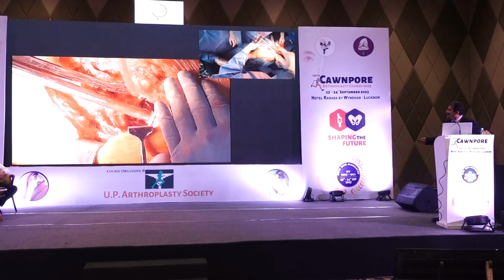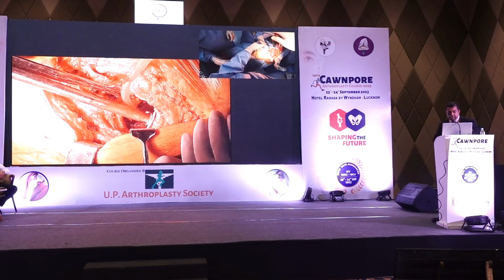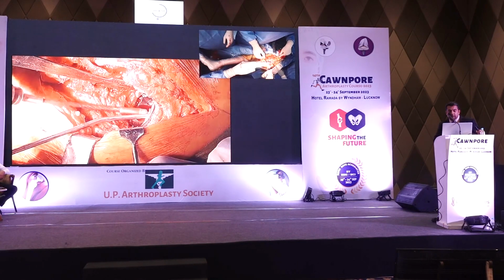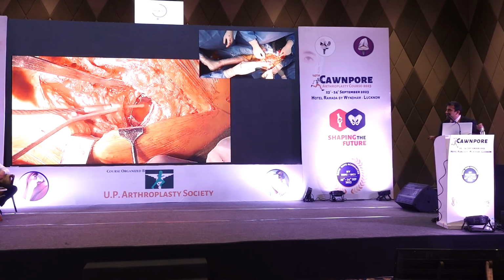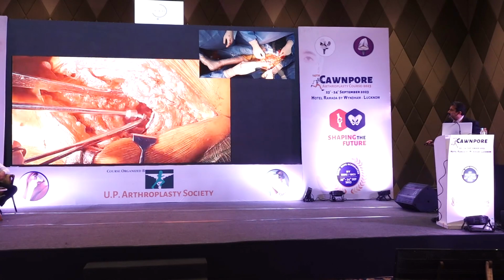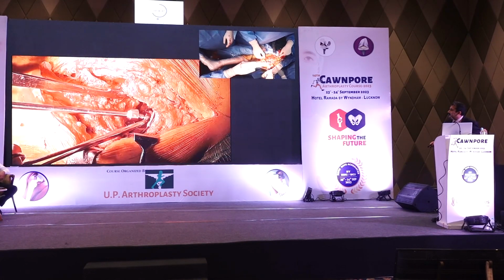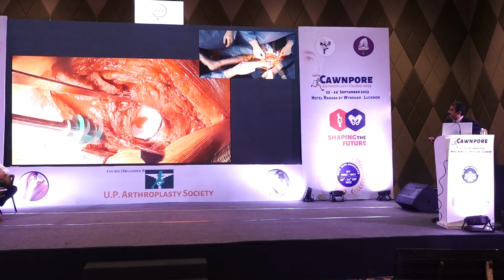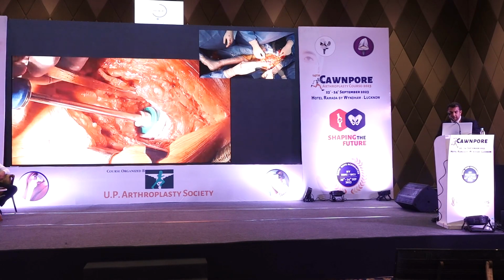And once you've done that, you do the placement of the screws. I usually use 2 to 3 screws. And I've used an offset liner as well.